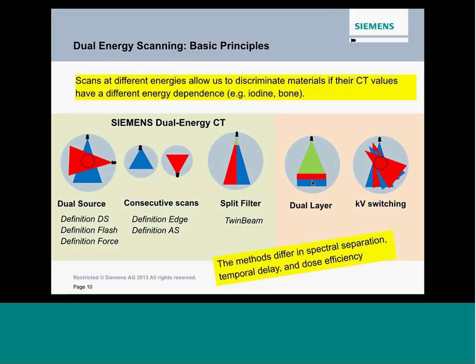spectral separation. The good thing about this is everybody technically is scanning dual energy, right? Because it's one source, one detector, even though that detector is two layers. So that is its advantage.